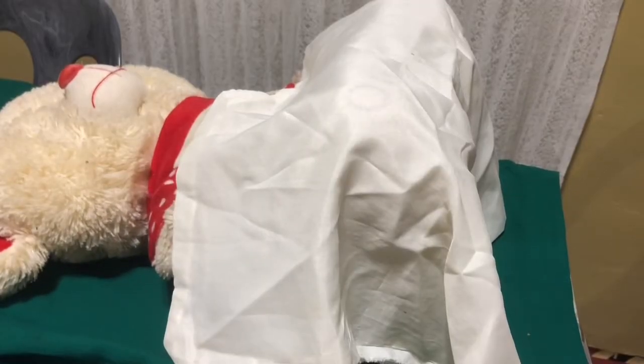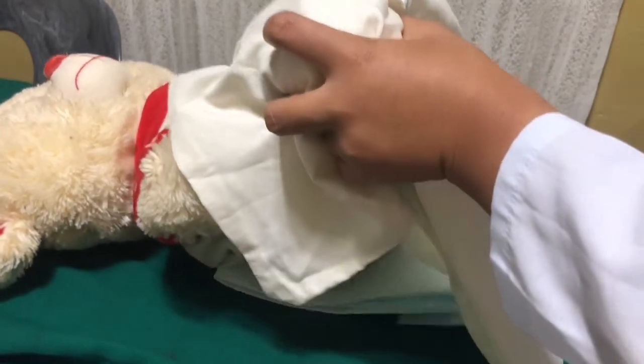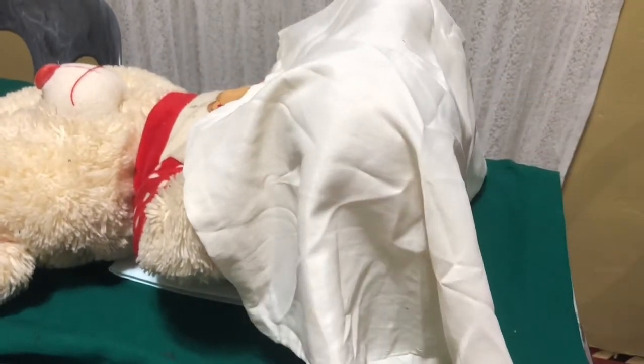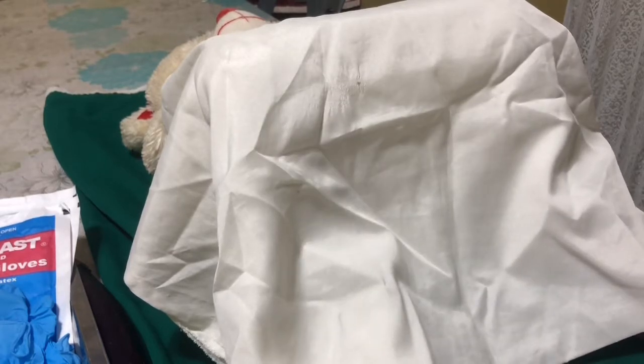Place a waterproof underpad under the client. Place the client in a supine position with the feet apart and drape the client.